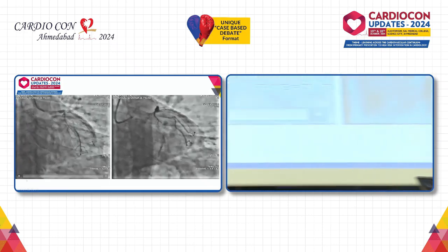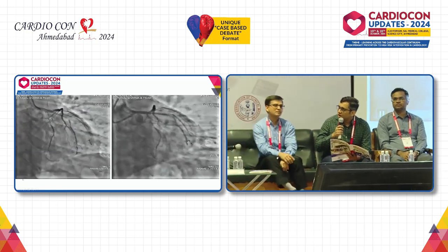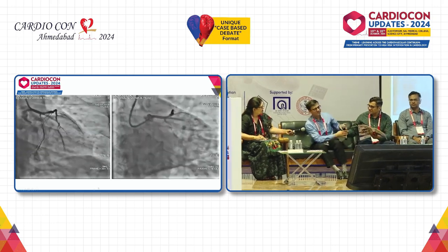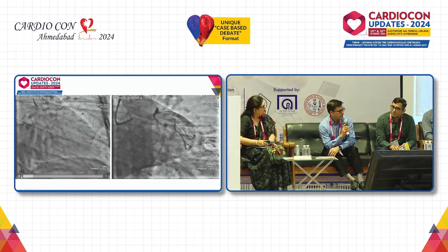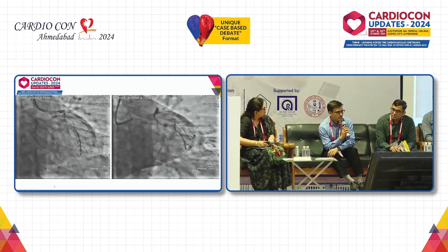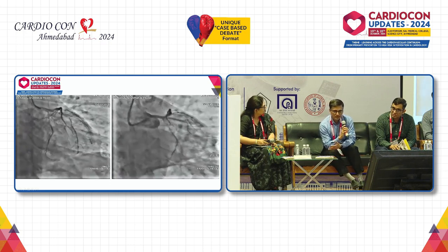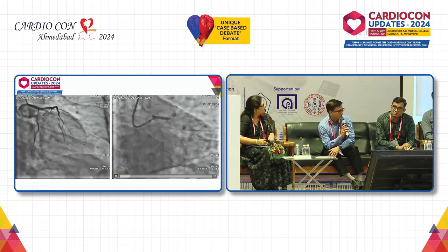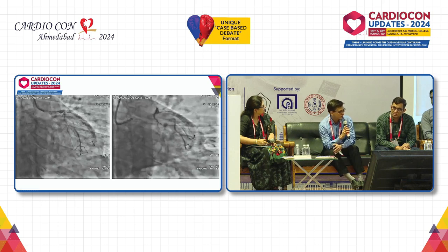I would like to ask Chirag bhai, do you believe in a stentless ostium in an isolated ostial LAD or ostial LCX lesion? It's a difficult anatomy to live without a stent at the LAD ostium or a circumflex ostium. Nonetheless, we have to still understand that the circumflex ostium is the Achilles heel. I mean, very high chances of restenosis, and the lesions are most often fibrotic. And therefore, it is intuitive. Whenever one sees left main, one would consider a stent to both, left main as well as LAD. I mean, LAD as well as circumflex.